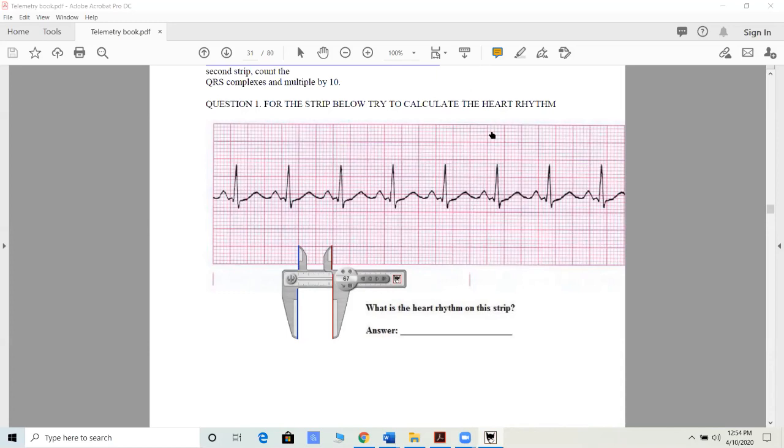Okay, I've got one answer so far. All right, I've got another one. Okay, good job to everyone. If you said 0.40 seconds, bravo, you were absolutely right. Now we can put all our puzzle pieces together, kind of like being heart detectives. What we're looking at now is everything seems to fit. All of the puzzle pieces seem to point to a normal sinus rhythm, okay?